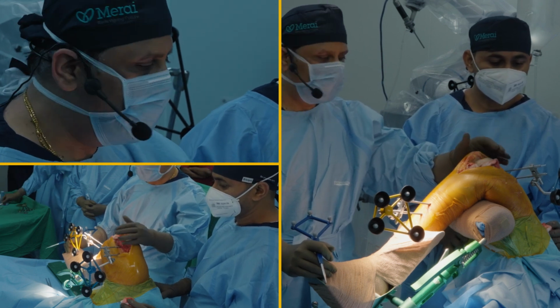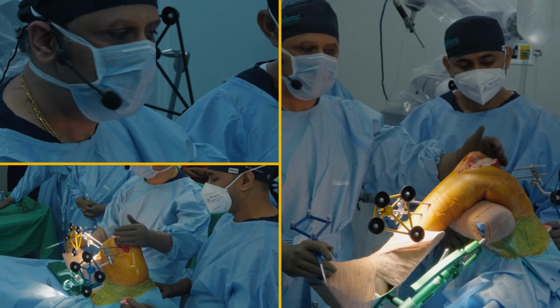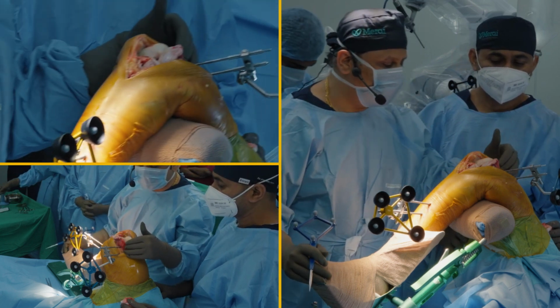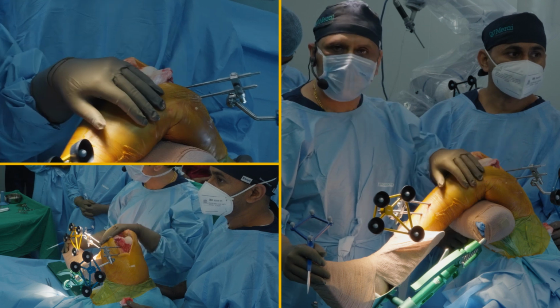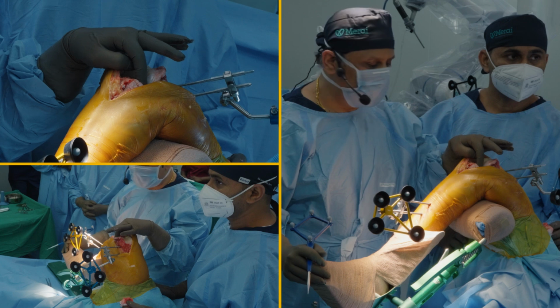I'm a medial parapatellar guy, so it's a midline incision, medial parapatellar arthrotomy done. Both the medial and lateral meniscus have been removed. I kept the PCL intact. I will see once I go in whether I should do a CR or a PS knee. I do both of them. So let me start with the markings. Okay.